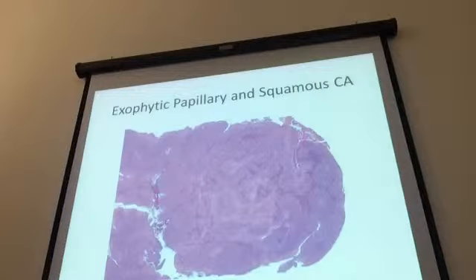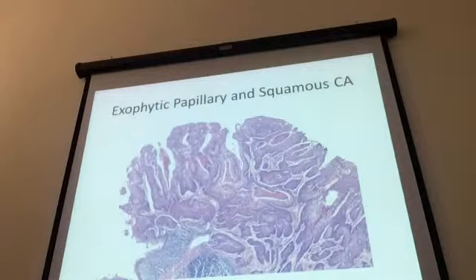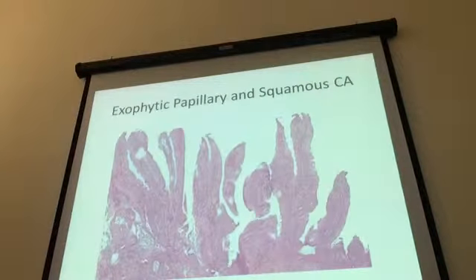So here's an example, a very broad papillary type pattern that we see here. Or another one, exophytic, broad squamous nests occurring, and not much identified invasion. So it sometimes can be hard to identify invasive cancer in this. Here's another example, long papillary fronds. Like in the oropharynx, it can sometimes have this inflammatory microabscess appearance. The cytology here, though, is malignant.